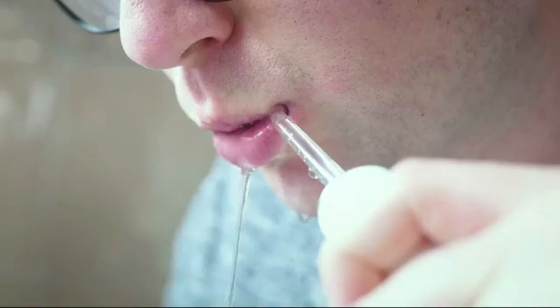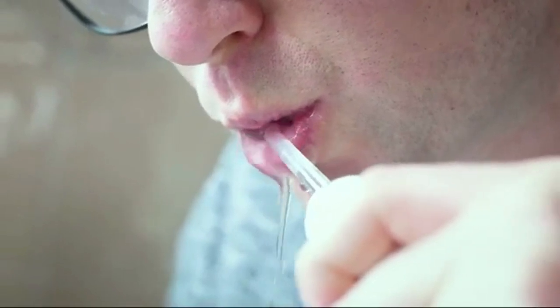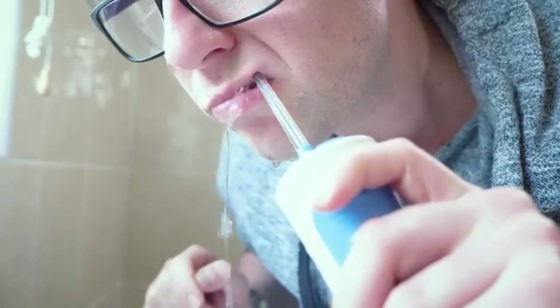Let me make clear the main cons to this product from the outset. The first is that if you are not used to using a water flosser, it can be messy. It takes practice to perfect the technique. Even with practice, you still have to be leant over a sink to expel all the water that is pushed into the mouth as you use it. This applies to all water flossers, irrespective of brand.